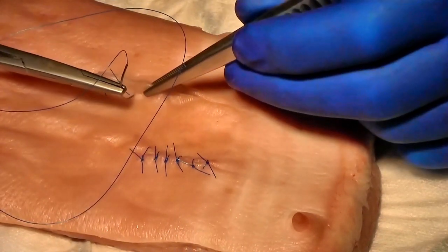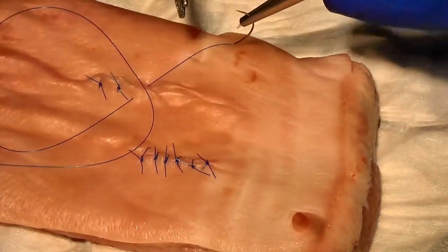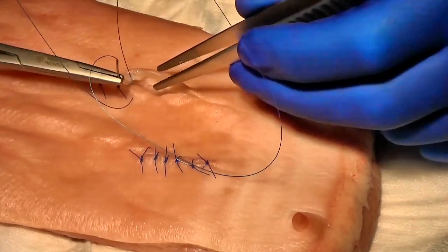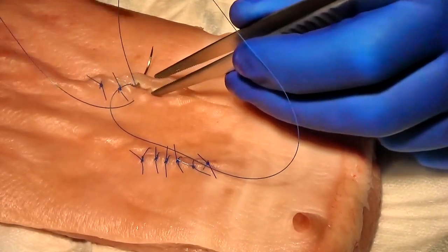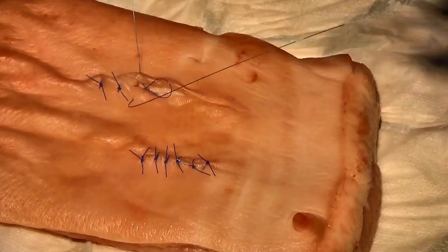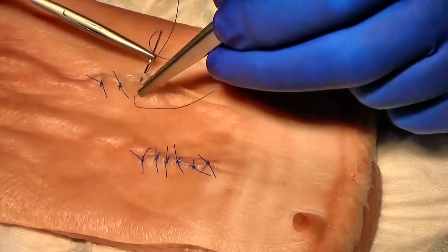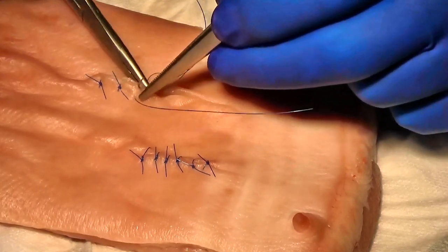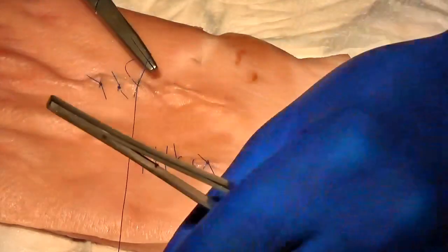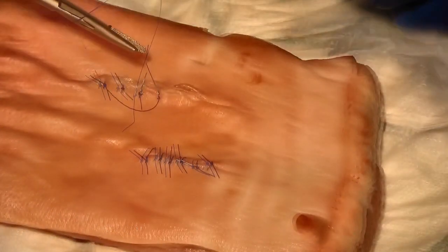We're now going to move on and just do a couple more sutures, and that will be the wound closed and finished. Bringing the needle out between the dermis and the epidermis and very close to the edge of the wound. If you don't do this, you'll end up with a wide gaping wound with the dermis exposed, leaving a wider, uglier scar.